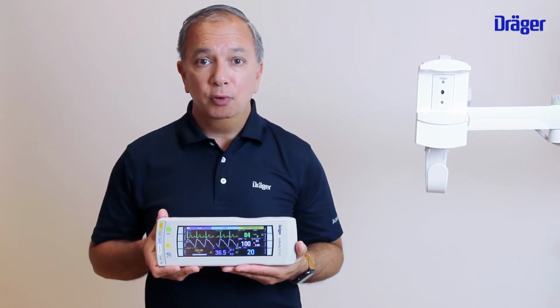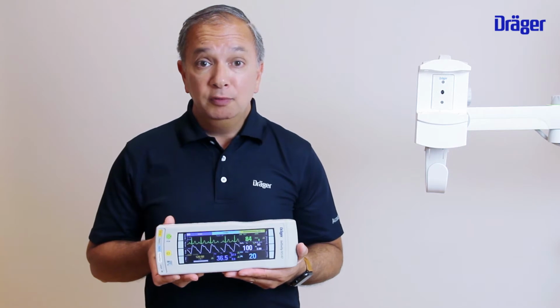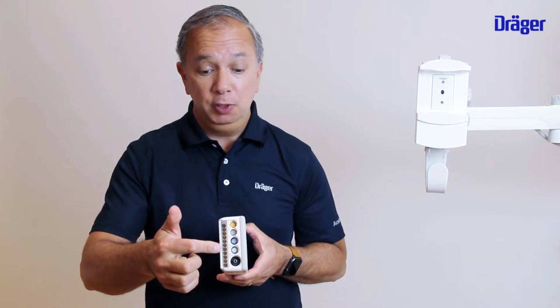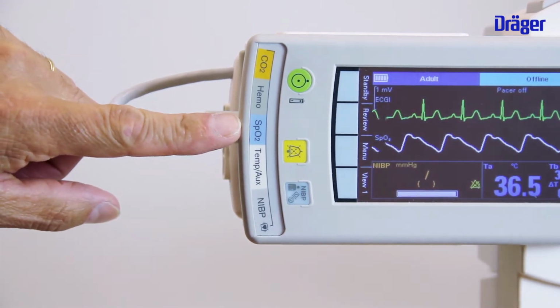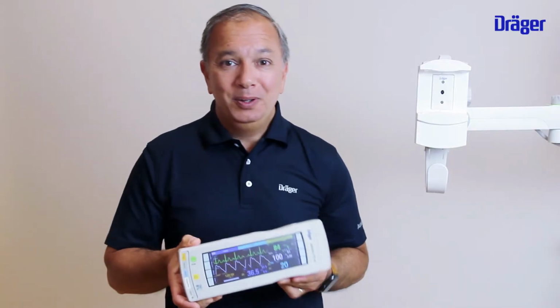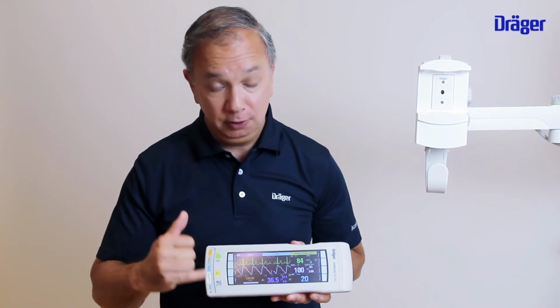You can use the M540 as a bedside monitor and as a transport module. You have different options. When you look at the side, you can connect your patient cables into that. So you have possibilities for ECG, IBP, temperature, SpO2, hemodynamics, and your CO2.